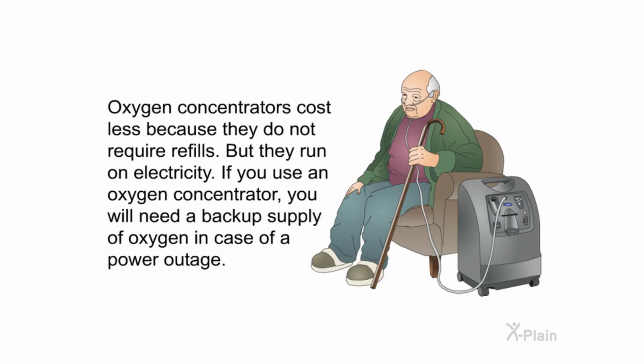Oxygen concentrators cost less because they do not require refills, but they run on electricity. If you use an oxygen concentrator, you will need a backup supply of oxygen in case of a power outage.